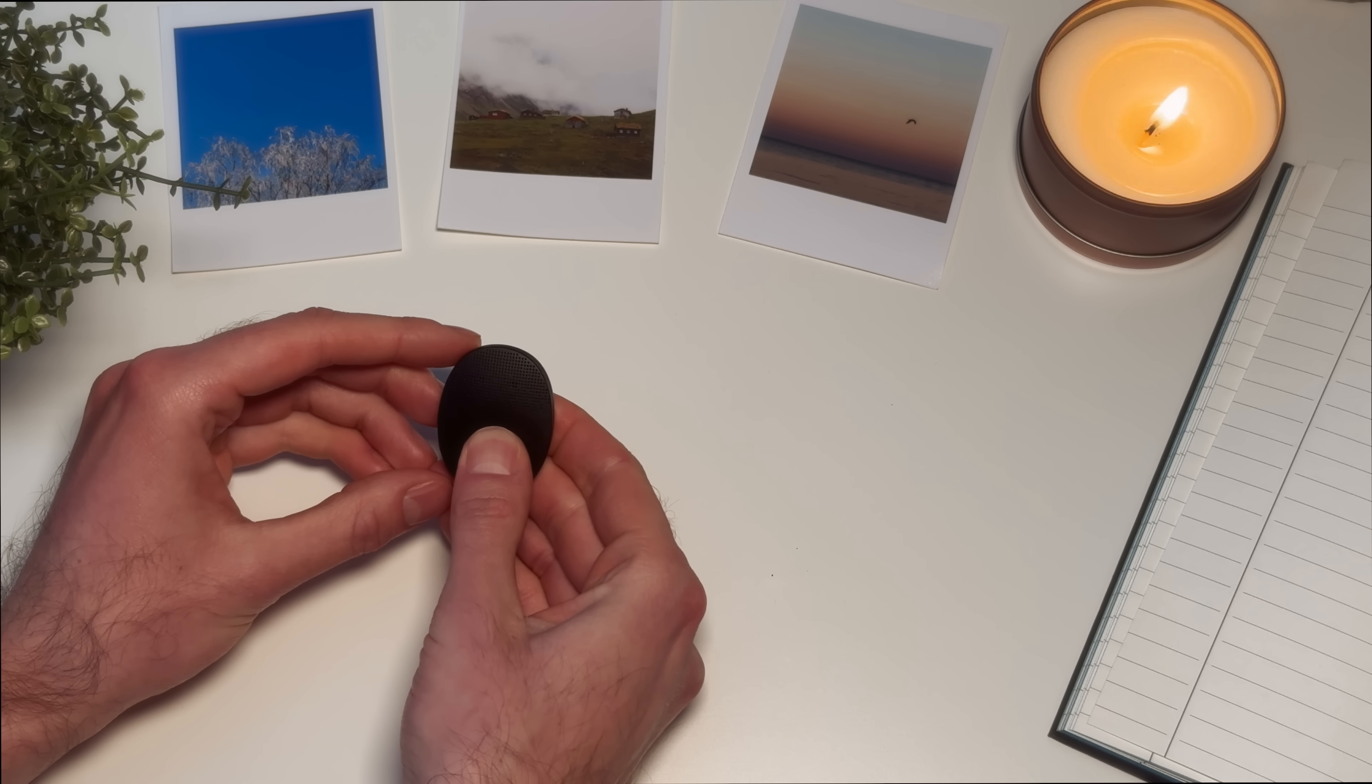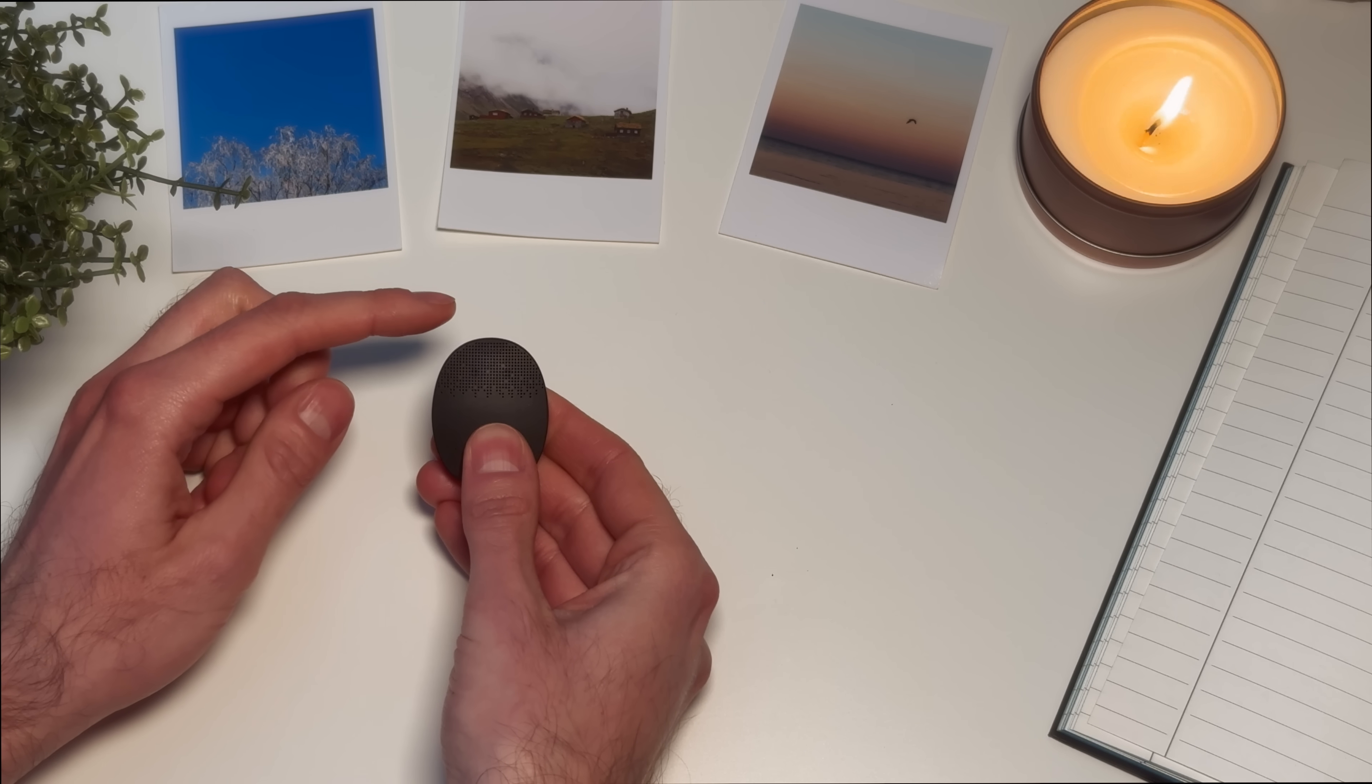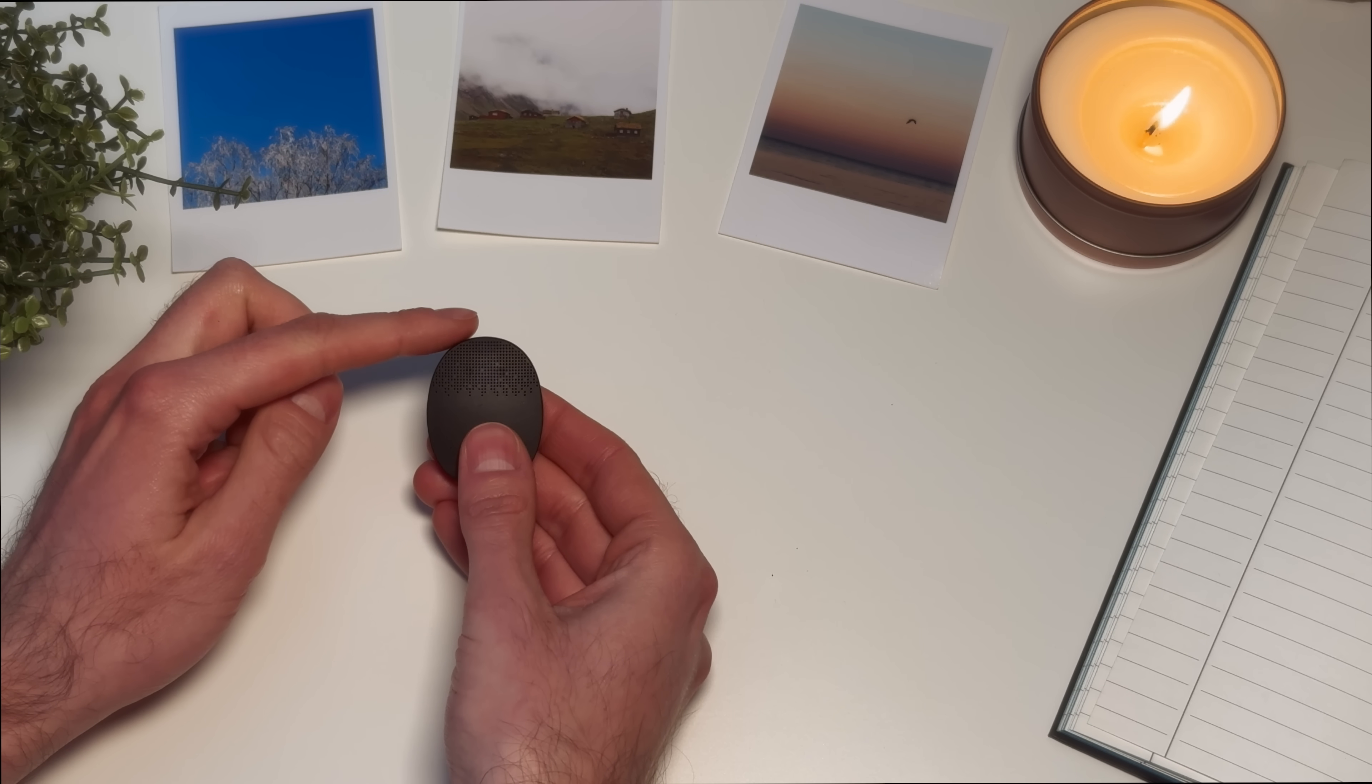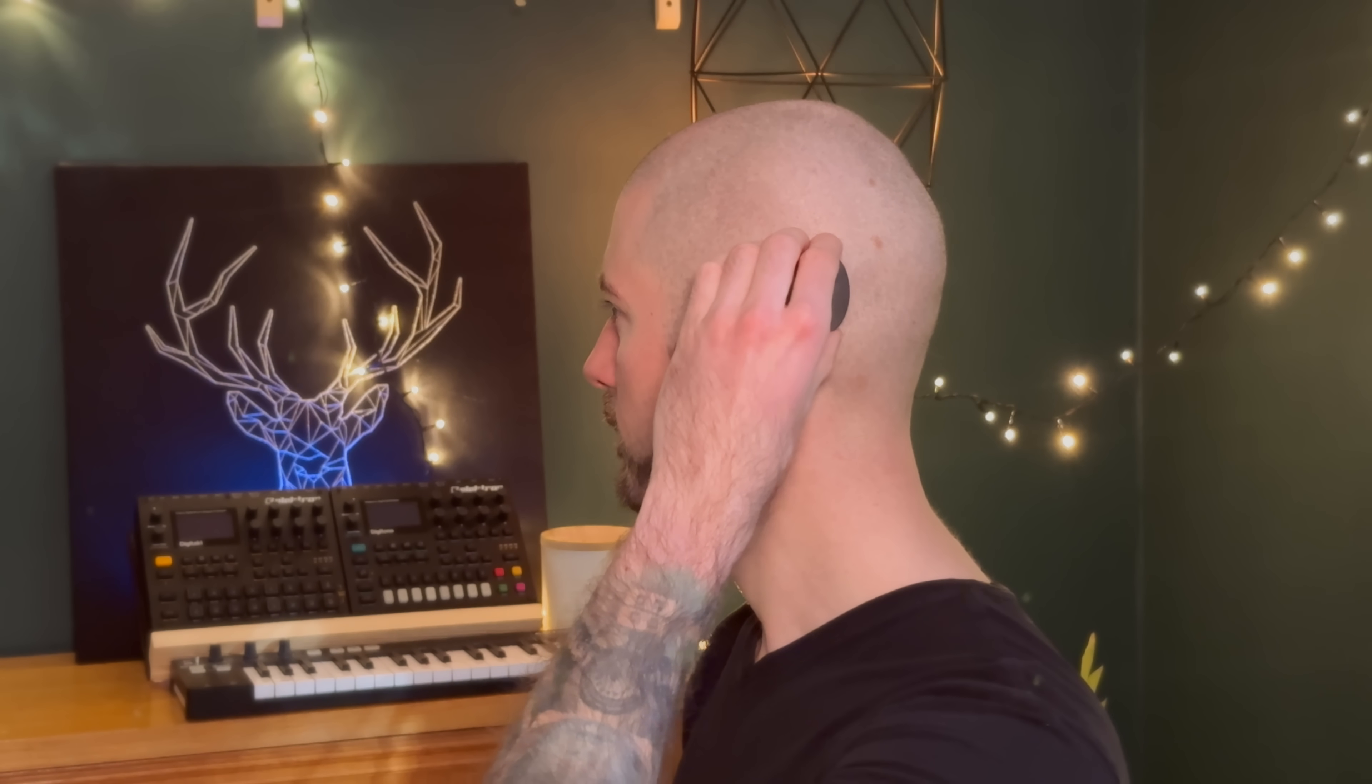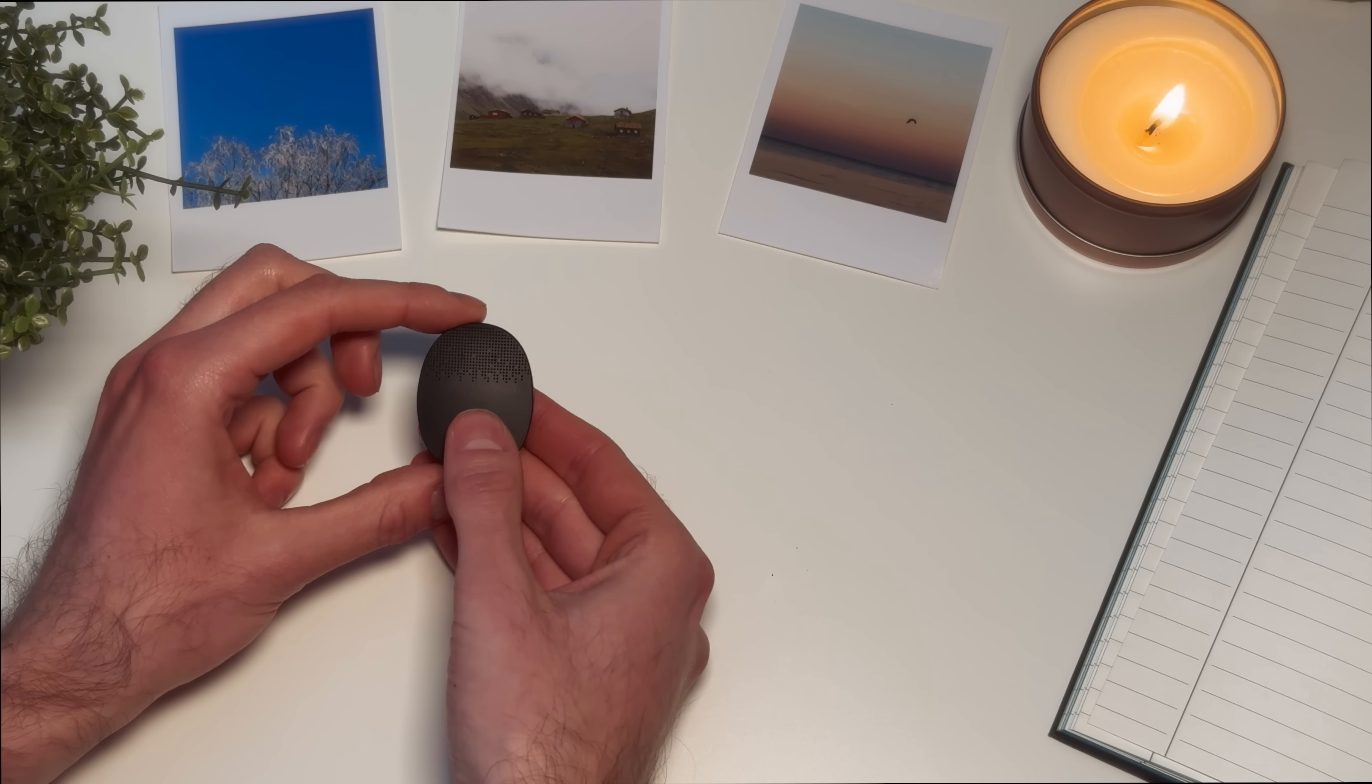When the audio processor is turned on, the main indicator light will fade to white. The main indicator light will then blink blue to show which program is activated. The indicator light will blink red if the link monitoring function is activated. The indicator light will blink green when RONDO 3 is correctly placed on your head. RONDO 3 should be placed over your implant with the MEDAL logo against your head and the microphones facing upwards.